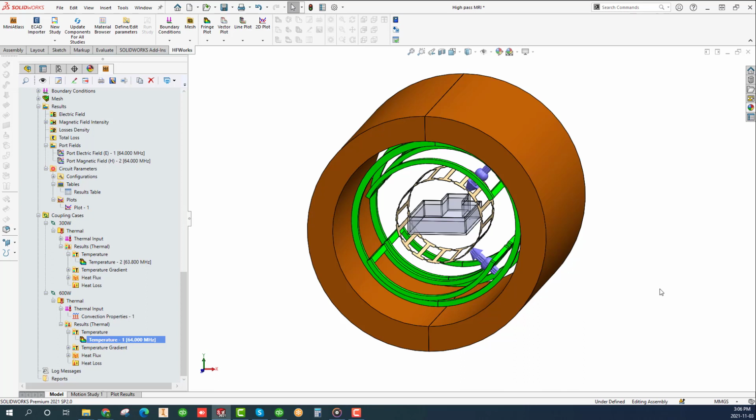To conclude, it is not safe to wear a metal during an MRI scan, not even gold.